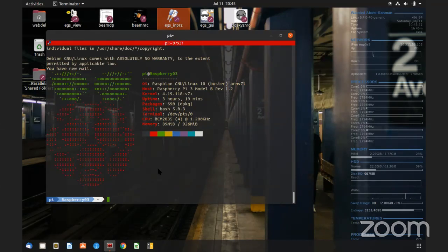So what you need to do is have one single server. This server is going to export the home area to all the other machines. You need a big hard disk for one machine. For the rest, you can just use something small, like 32 gig, because the home area is going to be shared from that machine. You also need NIS, the network information system, because you need privileges.